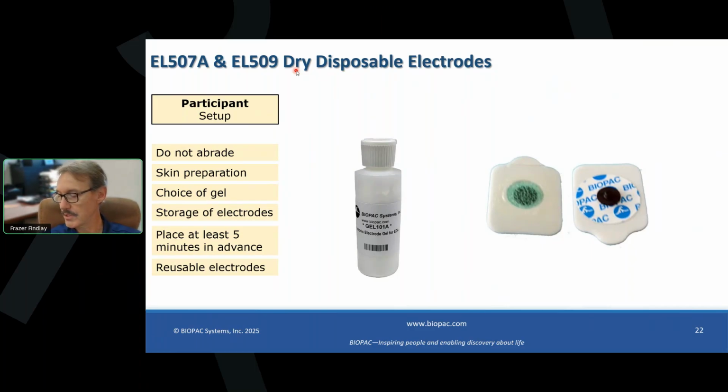And it's important that you use the gel 101. It comes in a little tube. And then all you're going to do is just place, I'm just going to give you an example here. Just a small amount, about a pea-sized amount of gel, and then you can place that on your location of choice.